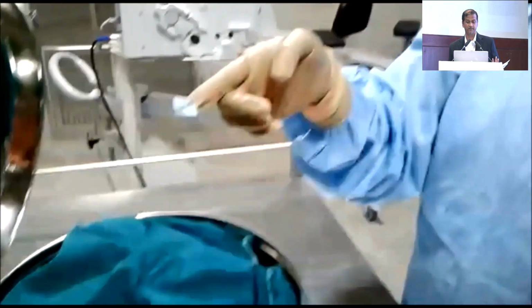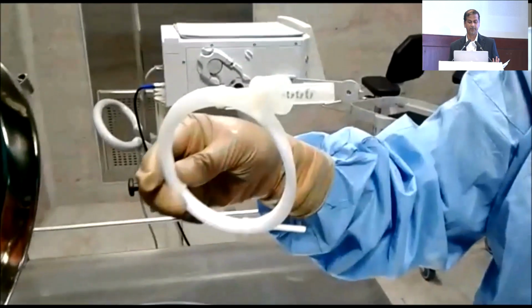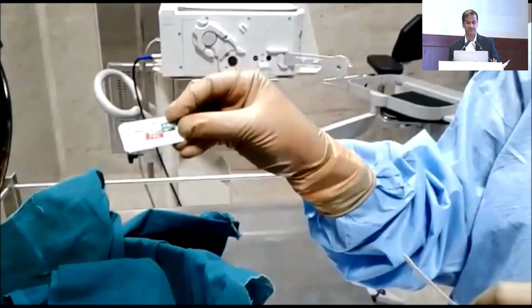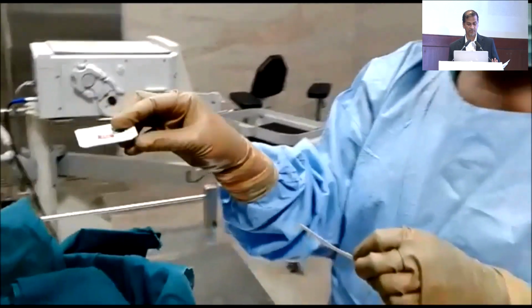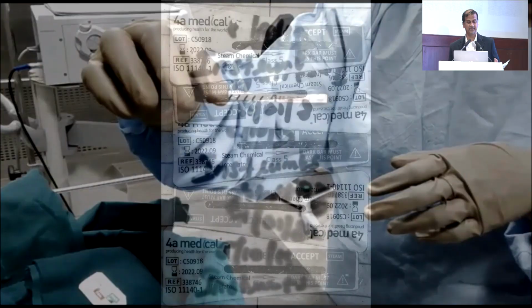So now the autoclaving is over. Once your nursing staff opens up the bin, ensure that all the indicators have been checked to ensure that the proper sterilization process has occurred. Here you would see the staff checking out all the things. So these are all the class 5 integrators which have been placed in each tray.